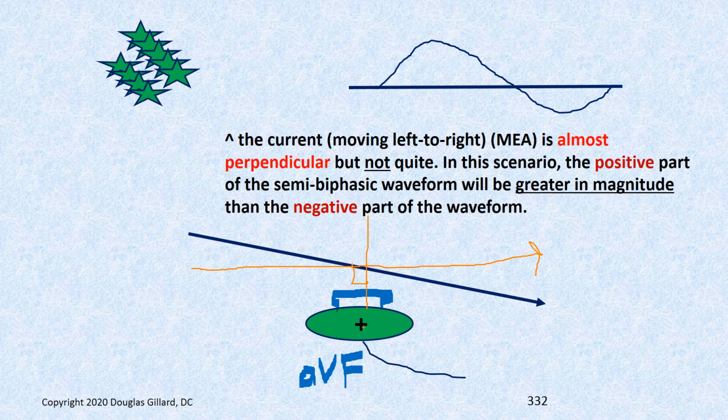So the camera, when it sees something like this, with the wave heading perpendicular-ish, but actually heading a little bit more towards the camera, then this would be away from the camera. If it's heading toward the camera, it's going to draw the positive part of the waveform bigger than the negative part of the waveform.